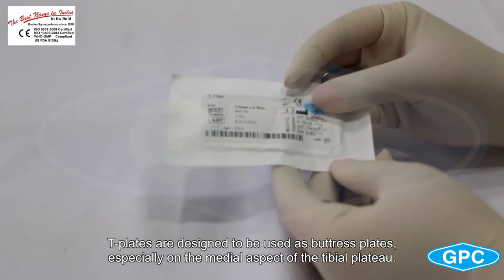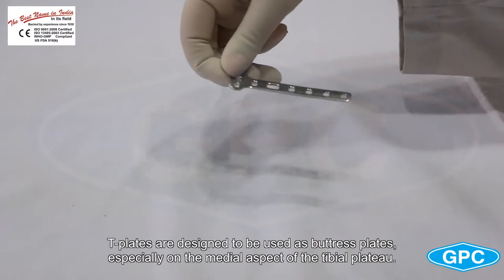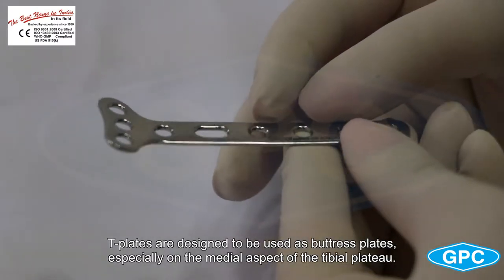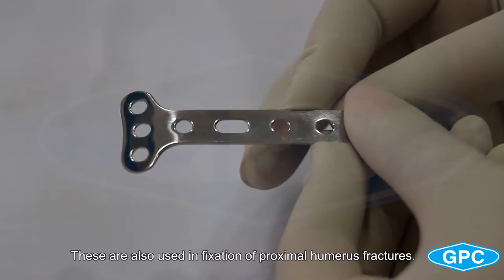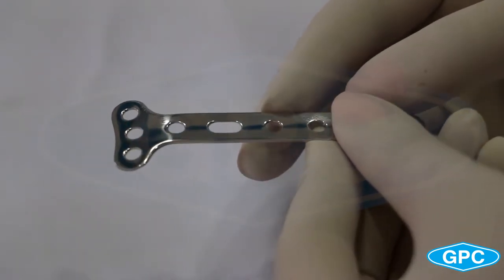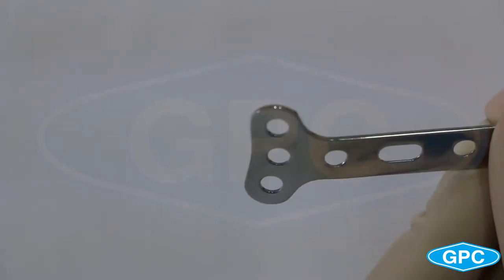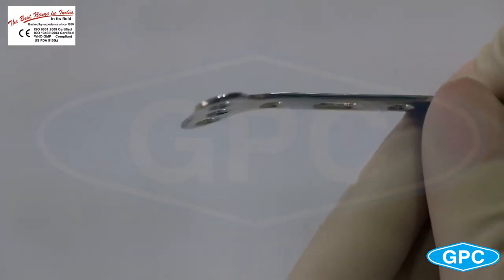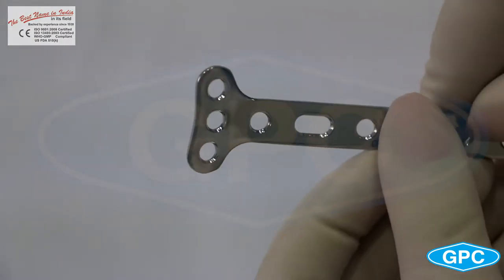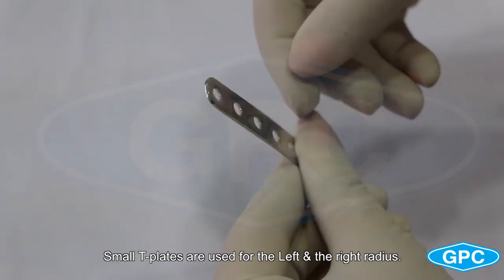T-plates are designed to be used as buttress plates, especially on the medial aspect of the tibial plateau. These are also used in fixation of proximal humerus fractures. Small T-plates are used for the left and the right radius.